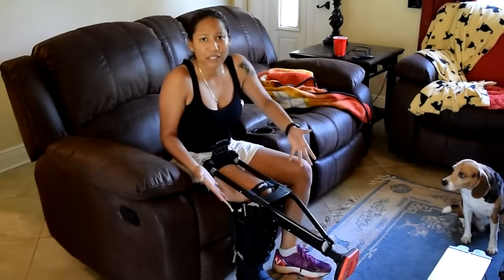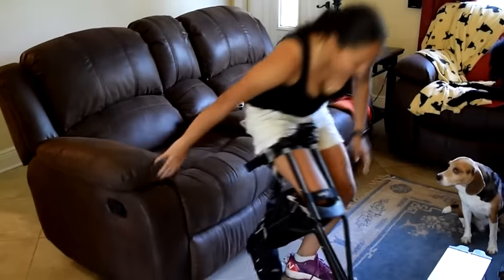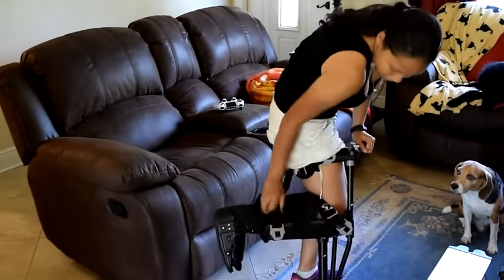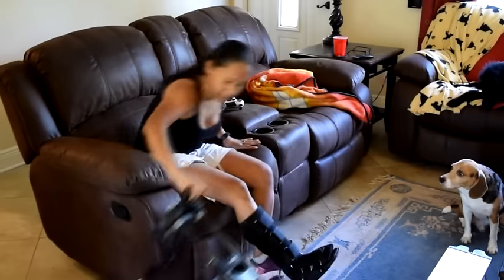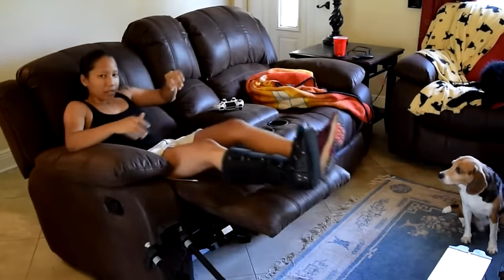If you want to just take it off, it's as easy as — you'll get used to it too. Just loosen, loosen, loosen, pop out, pop out, pop out. And I normally just do something like this. Now I'm good.